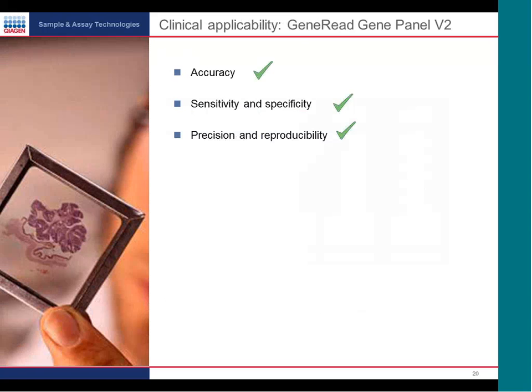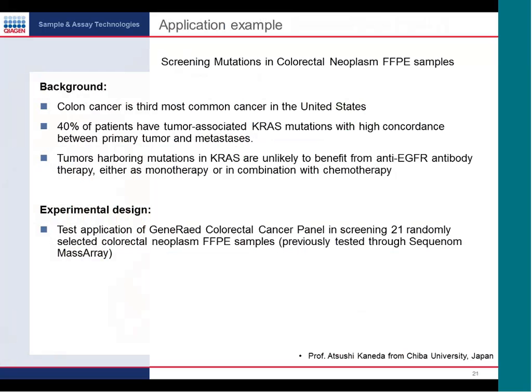So basically, after this testing, we have ensured that we have high accuracy, sensitivity, and specificity, as well as precision and reproducibility. After confirming this, we went ahead and did a short case study in which we used our colorectal cancer panel to do the screening in colorectal neoplasm FFPE samples.